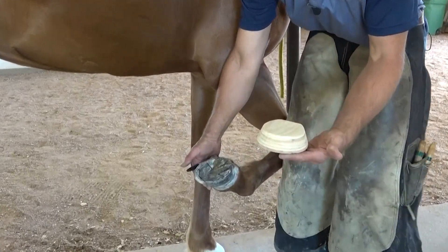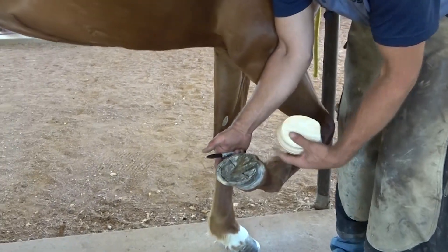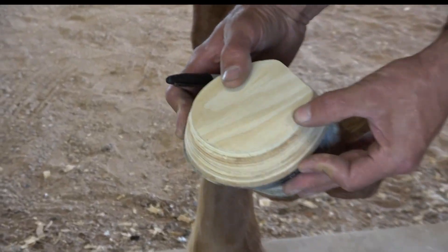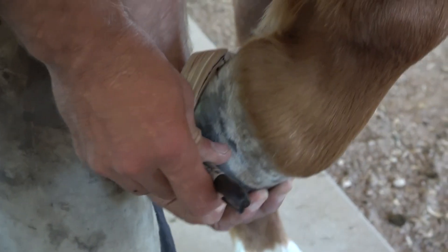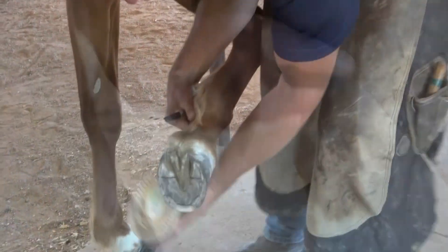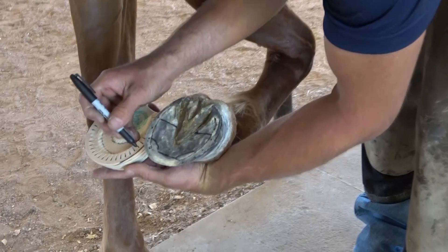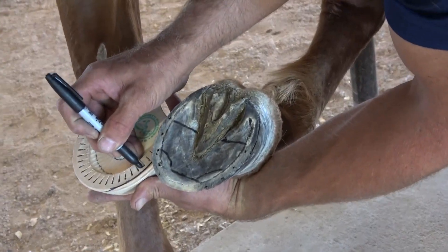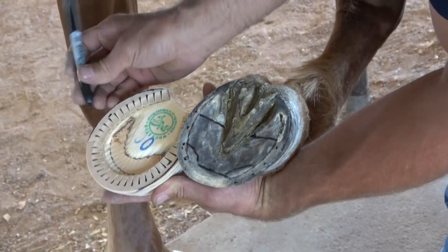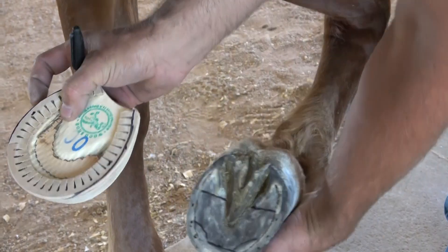We're going to go through the process of casting on a wood shoe. So we got our foot trimmed, prepped, and mapped. We're just going to trace the foot on here — what this helps me do is know where the hoof wall is going to be. Looking at how thick our hoof wall is on both sides, that lets me know where I can place my set screw safely into the hoof wall. It's roughly a quarter inch thick, and I'm going just under a quarter inch with my marks here for the hole I'm going to drill.